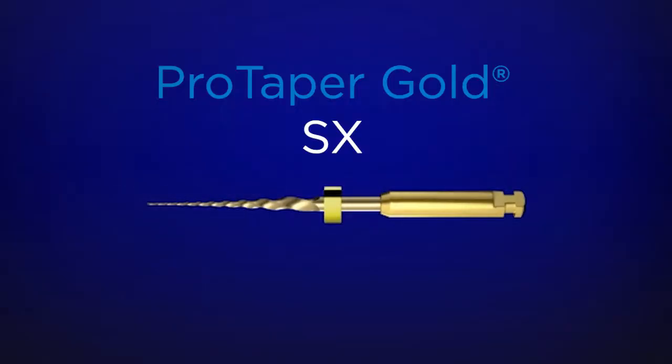The number one international instrument used internationally is ProTaper Gold Shaper X. It's the auxiliary shaper from the ProTaper Gold family of instruments. Notice it looks a little bit short to your eye, and it is — it's short, so it can be introduced into narrow interocclusal space.